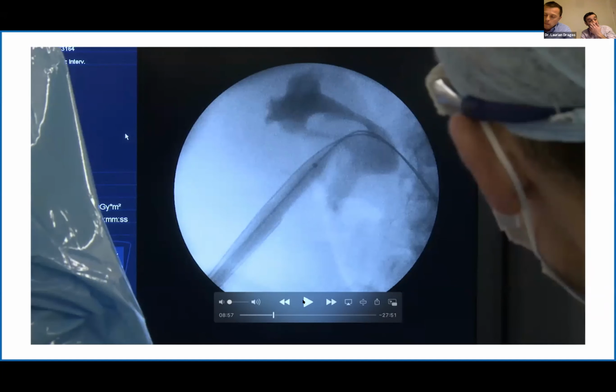Yeah, definitely. I think, for example, if we're doing purely an antegrade ureteroscopy, then we would go to 11-13 French dilation using the standard access sheath. So if we anticipate using a smaller mini PCNL, then we'll adapt and use a serial dilator. And if you're going to use multiple tracts.